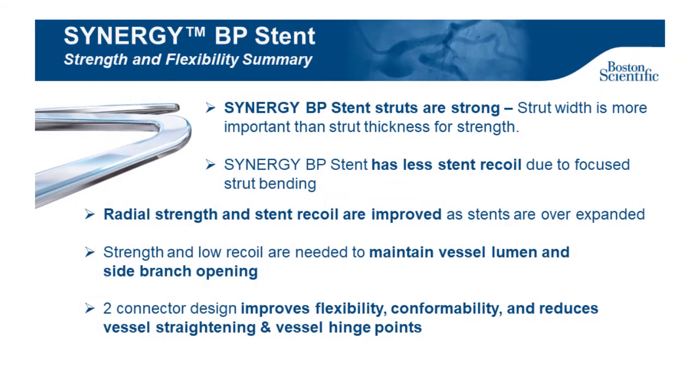We've covered a lot of great content today that will help you further your credibility with your customers and drive our overall stent business. I'll close by reviewing a few key takeaways from today. Synergy BP stent struts are strong. Strut width is more important than strut thickness for strength.